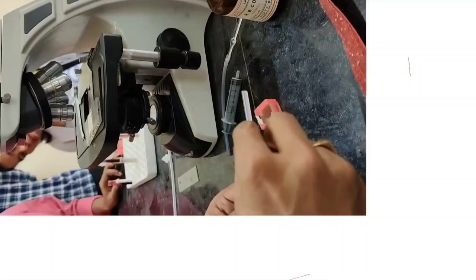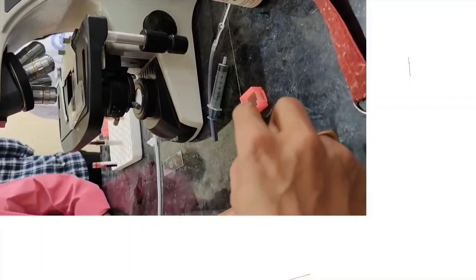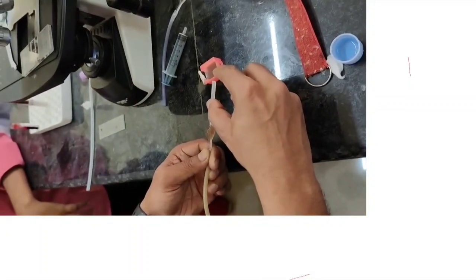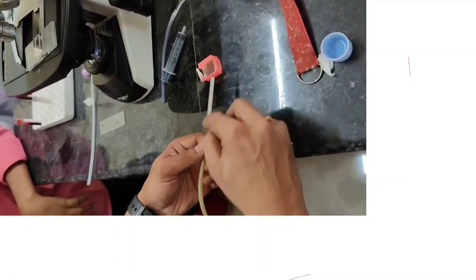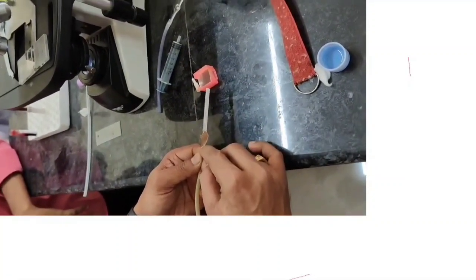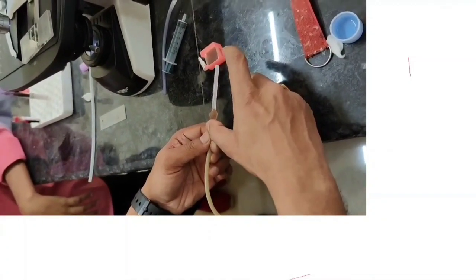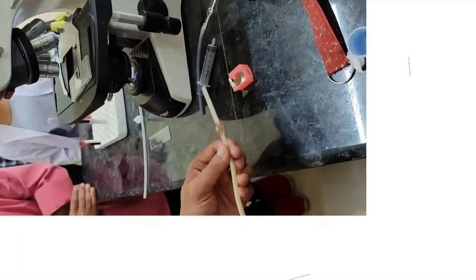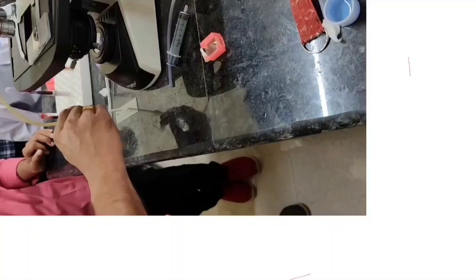Yes, so I'm going to discard the stem part of the fluid now, as the stem part only carries the fluid. 101 minus 1, so the final volume will be 100, divided by 0.5, as the initial volume was 0.5 of blood. So 100 divided by 0.5, you will get the total dilution factor of 200 times. So now I am going to discard that stem part.